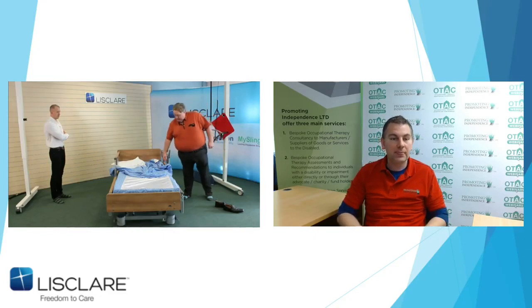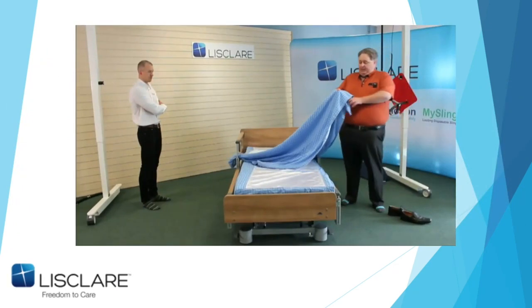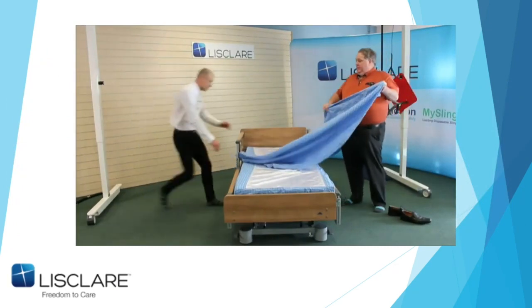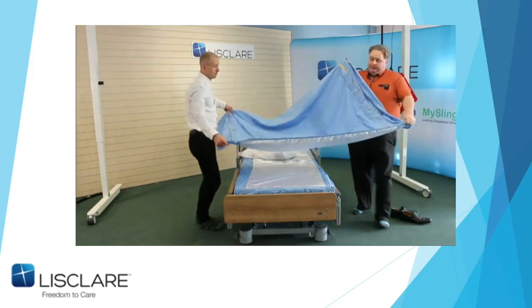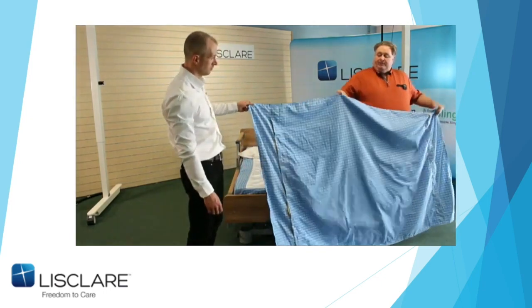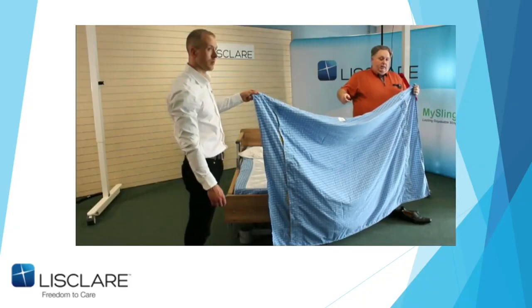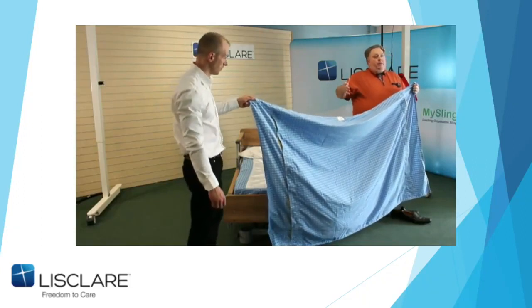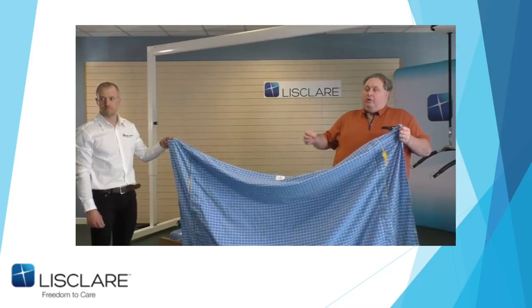There is a particular reason for that. Okay, and this is the biggest learning curve that I had. John, you and I will show this. Okay, just so you can see this. Just drop that sheet down. Right. This is one of the hassles that when you send this out, people have to see that that's top. You can get a full length sheet, but there's too much sheet then involved in the turn, and the person's heels are on the bed, or on the sheet.